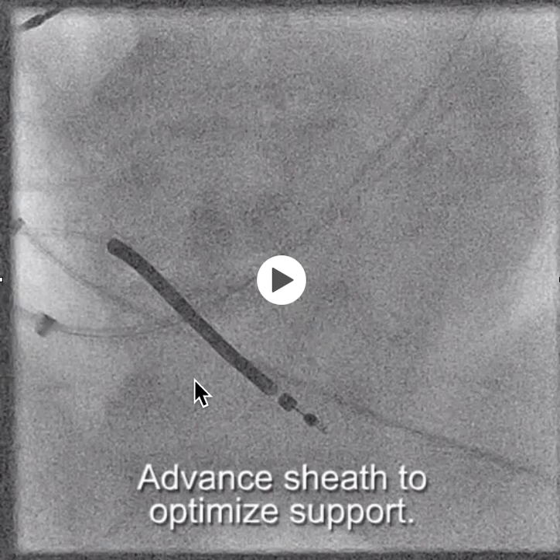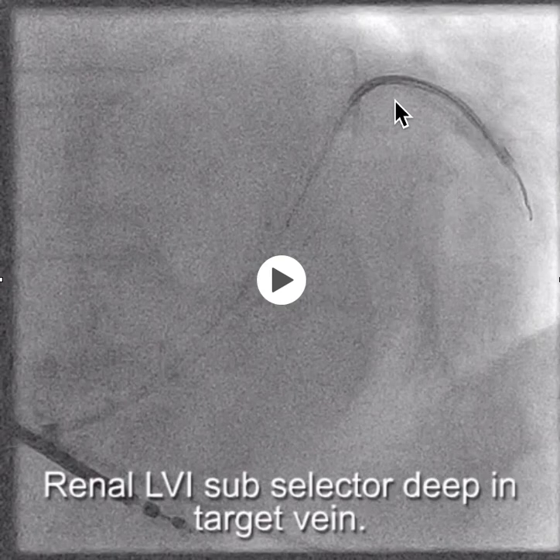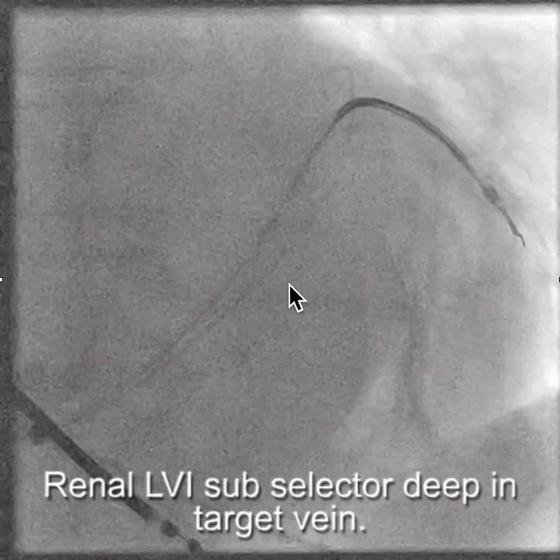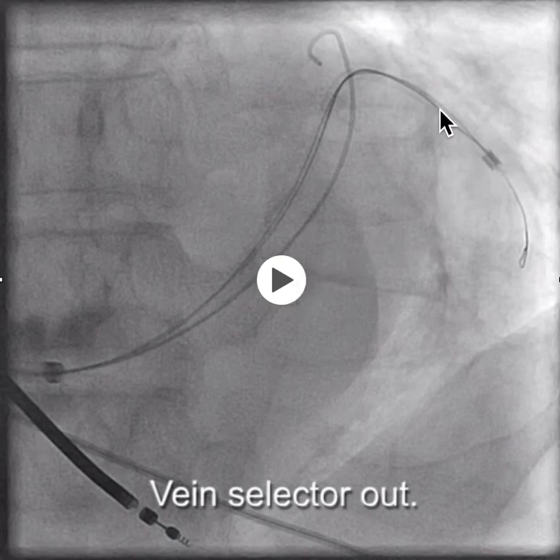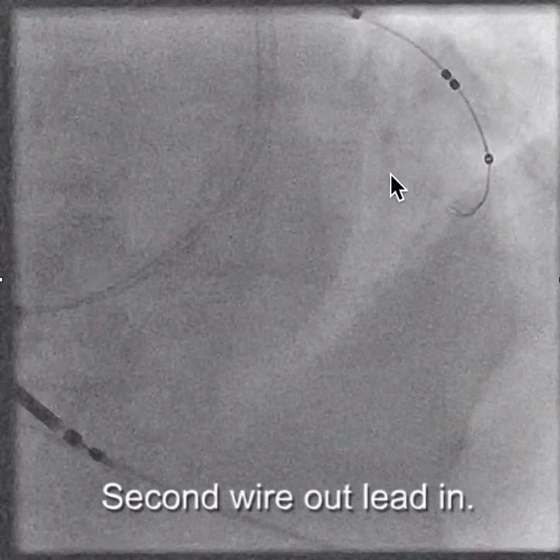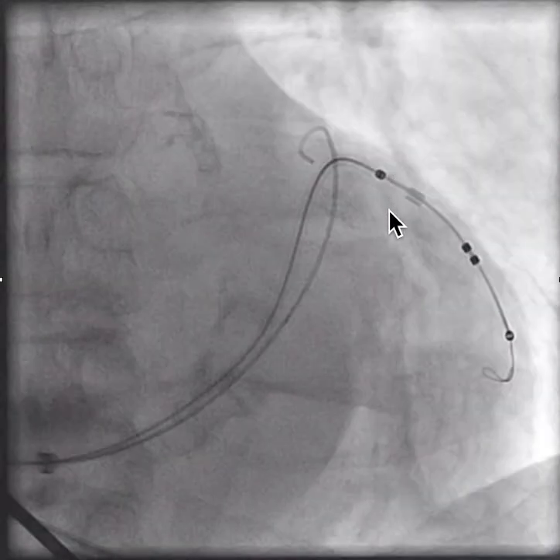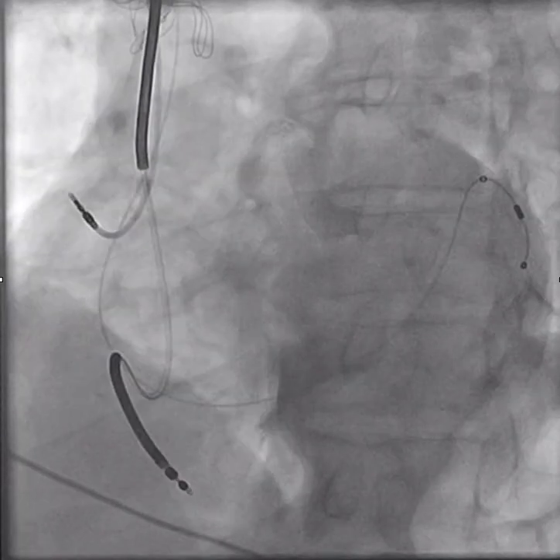When you do this, you want to make sure you check to see how the sheath is doing. So we're going to snug the sheath up into the CS as far as it will go. Now we have the vein selector here, and the subselector all the way out there. We get our wires back out, and now we've taken the vein selector out. We still have two wires in here — remember, there's not enough room for two wires and the lead, so you have to take one of the wires out, then the lead goes in. You're pretty much guaranteed to get the lead at least as far as the tip of the vein selector, which was all the way out there earlier. And so there we have the implant.